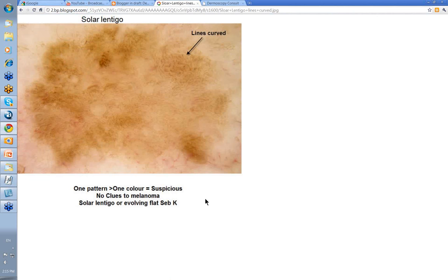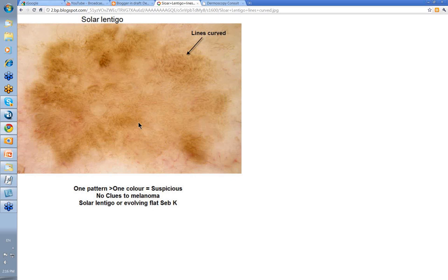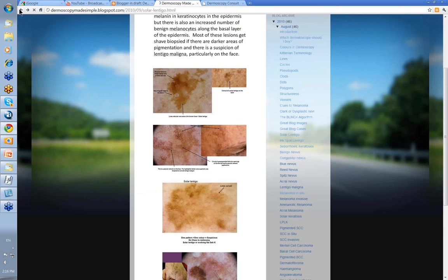Solar lentigos typically in other areas actually have lines curved — that tends to be the picture you see with them in non-facial areas. Lines curved are a particular feature of solar lentigos or an early evolving seborrheic keratosis. Looking at this case, I don't think there are any great clues to melanoma there, but it was biopsied and it was just a solar lentigo.